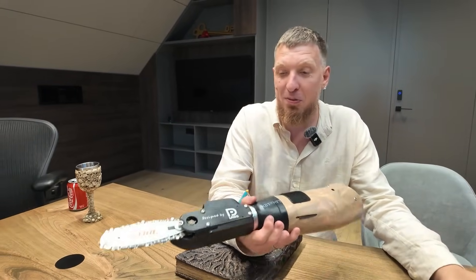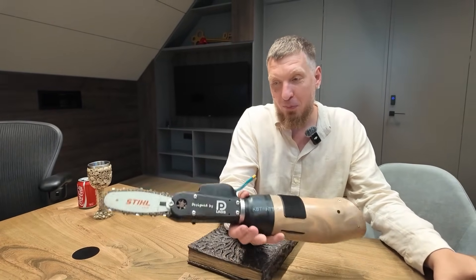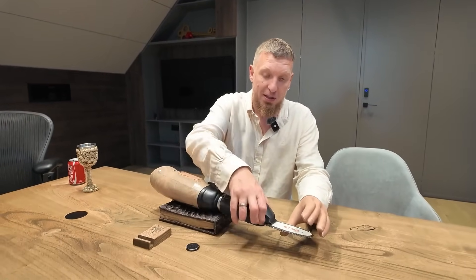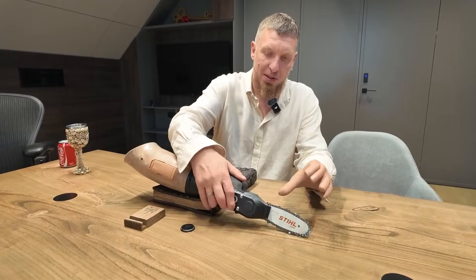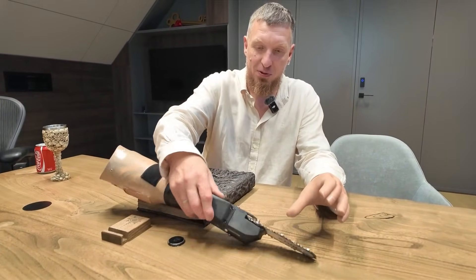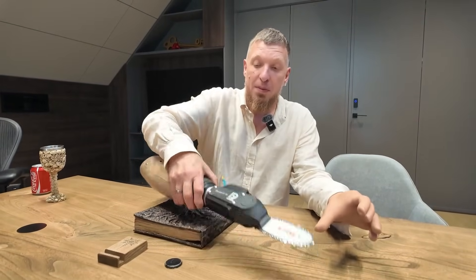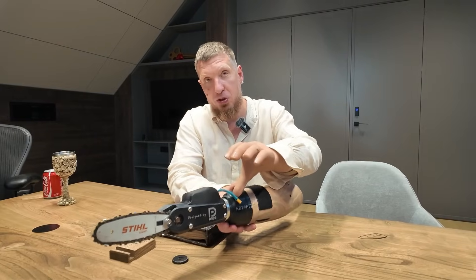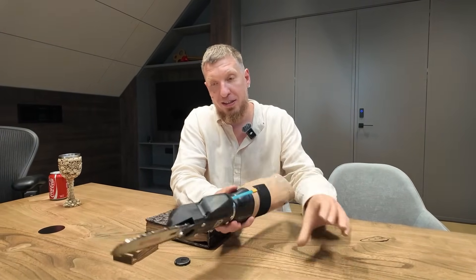Lebanon's team made this for me. Look how beautiful everything is here. From the branch saw we took the bar and the motor, made a new body, printed it on a 3D printer using resin, and the side plates are made of aluminum.